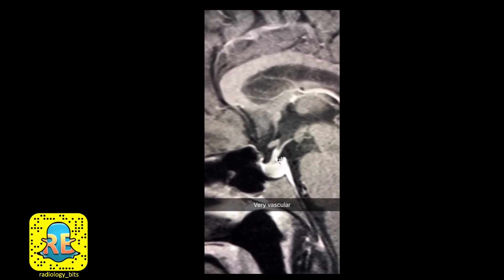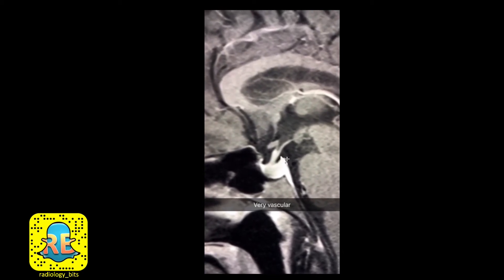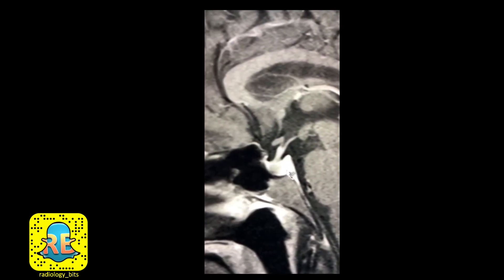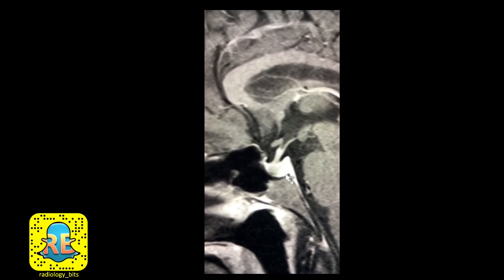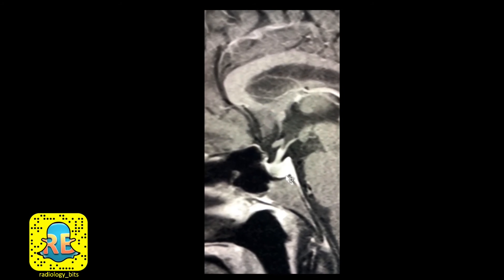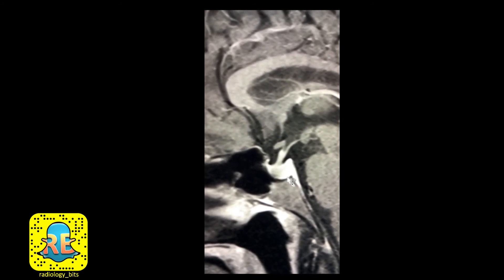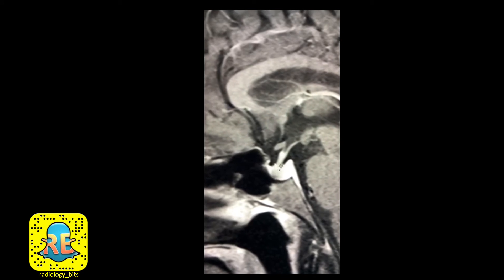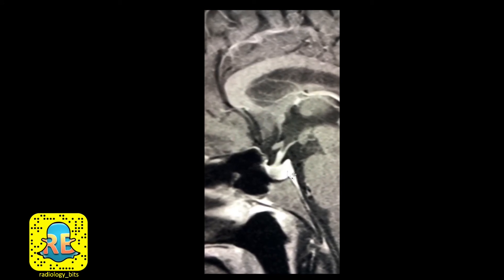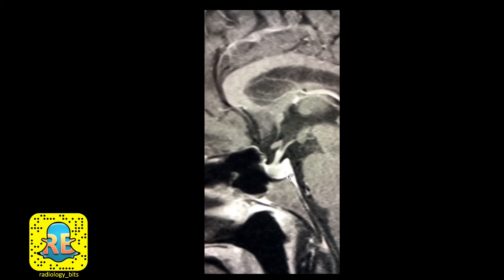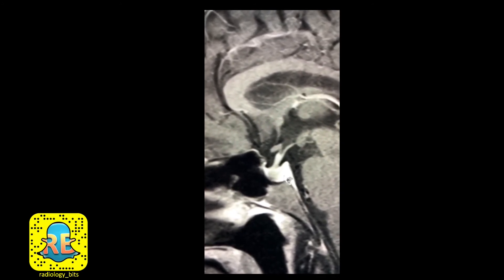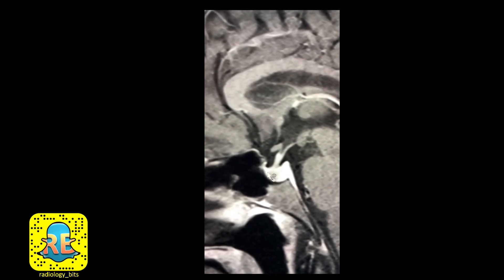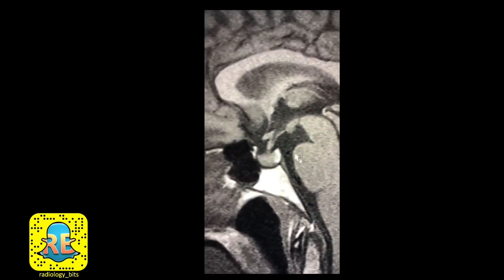Contrast also allows better delineation of the size and appearance of the stalk itself. The normal size of the pituitary gland depends on the patient's age and hormonal status. Younger adults have a bulkier gland compared to older patients. Patients who are pregnant or at puberty — where there is lots of hormonal activity — will also have a bulkier pituitary gland.